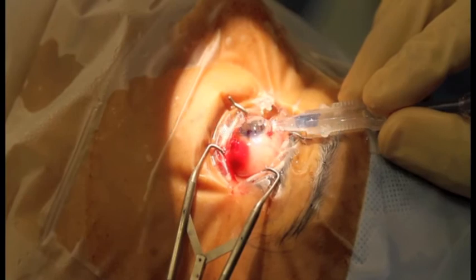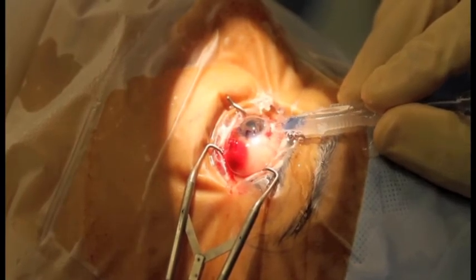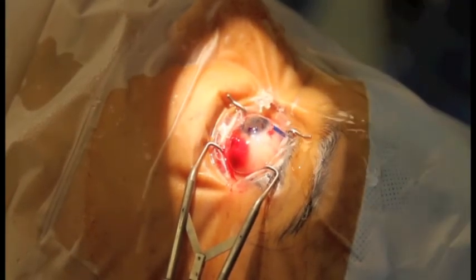The device is simple and effective, but be sure to use an Alcon B cartridge and not the larger A cartridge, as this causes too much leakage from the rear of the device and also from around the wound, as you can see in this video.